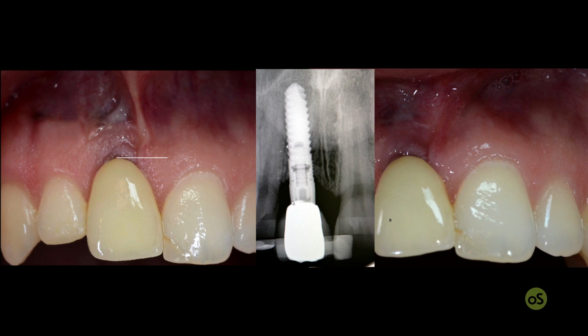You will see too much buccal inclination with too much buccal emergence of the implant shoulder. And this was the consequence of the immediate post-extraction implant that was adopted by the previous dentist, who also made some bone augmentation procedure at the buccal aspect together with the immediate post-extraction implant.